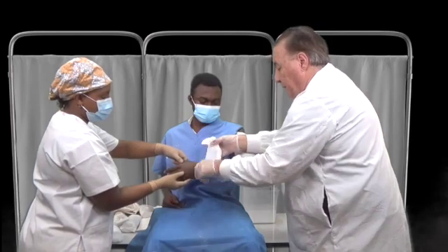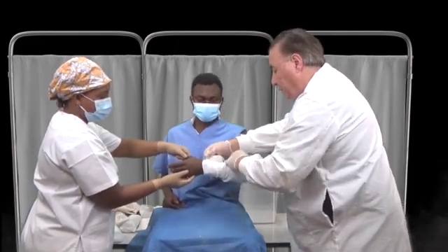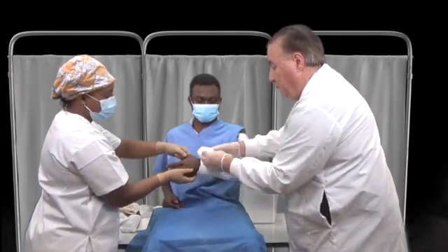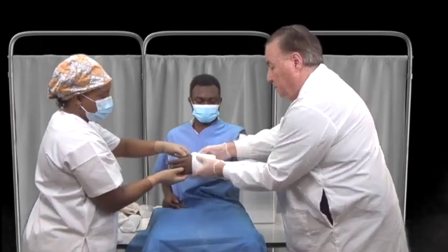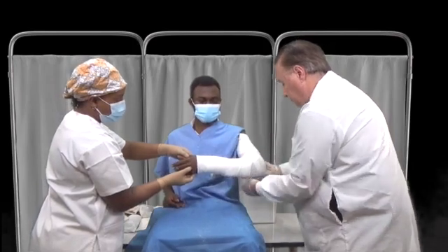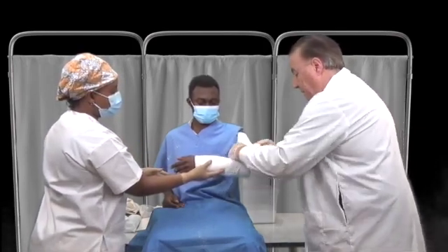In fracture management, you immobilize the joint above and below the fracture. In this case we haven't quite made it to the wrist, so we would want to immobilize both the elbow and the wrist. We'll add some padding and go a little bit higher so that the wrist can be immobilized, and make sure we have adequate padding particularly at the elbow. Bony prominences like the elbow can be problematic, and adding padding protects them.